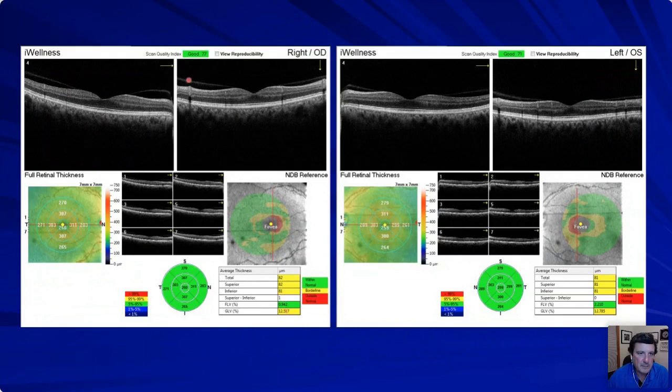And then I just wanted to, before I animated that slide, take a look. There is a little bit of, this is a vitreomacular adhesion. This is not a vitreomacular traction. This is the new terminology. Everyone out there has vitreomacular adhesions. Our vitreal face is up against our retina, and then it becomes more visible as we age. This would be a broad-based vitreomacular adhesion because there's no traction. You'll see that in a second. I dropped the slide in a little bit earlier before starting the presentation.